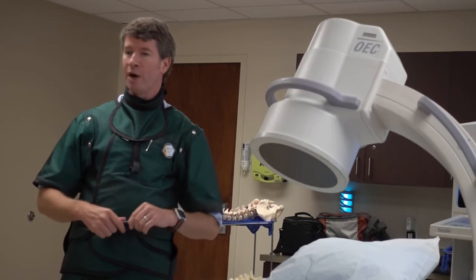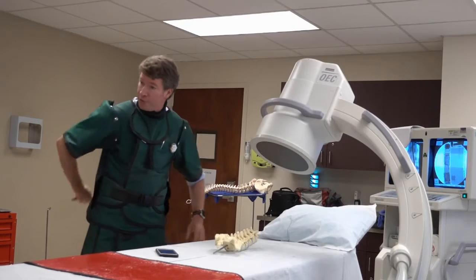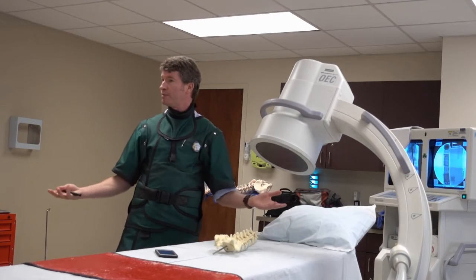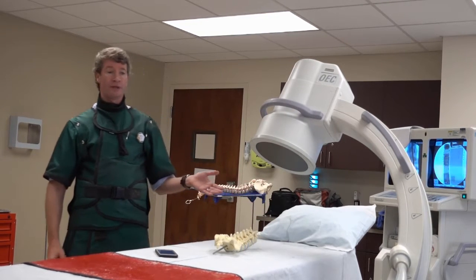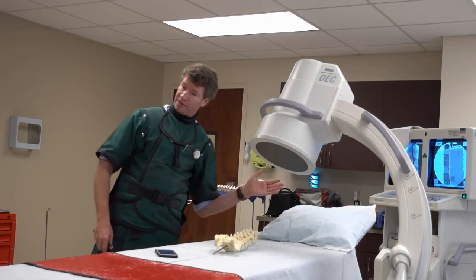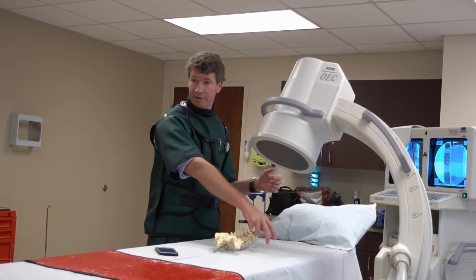But just think about whatever the anatomy is. We're often going to the front of the knee, so the front's going to be up. We're going through to the back of the spine, so the front's going to be down. And you can generally make an assumption about the position of the patient. Sometimes they'll be in a lateral position, okay? We put the patient in a lateral position, say if we're putting in a pump, we'll have them lie on whatever side down, with the spine exposed, and also the belly exposed.